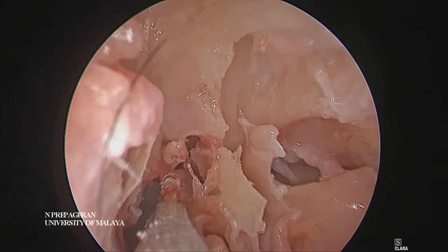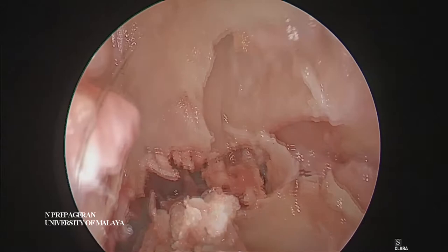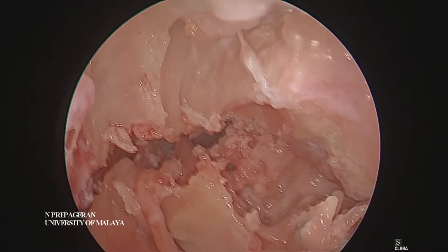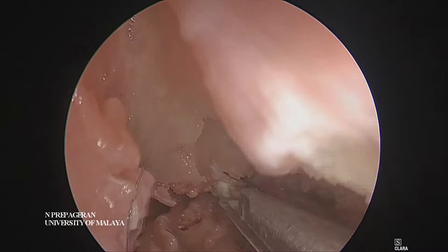That is already the frontal sinus. If you go like this, you will never go wrong. Can you see frontal sinus there? You come across and that's frontal sinus on the other side as well. And so this is the frontal sinus on the other side — going right in the center. And that's Lothrop done without a drill, with a Kerrison punch.